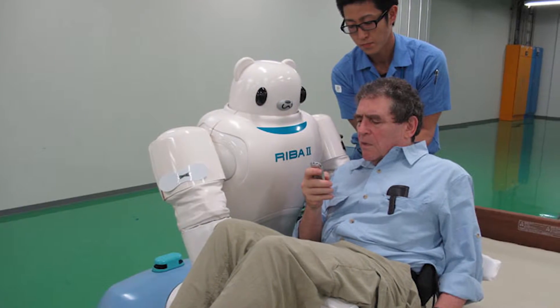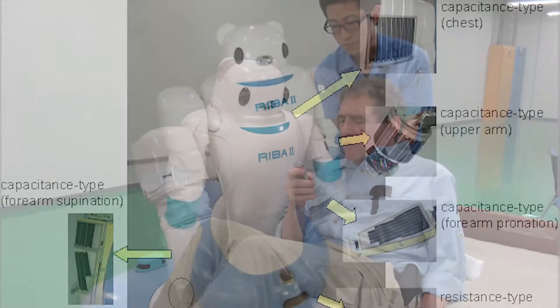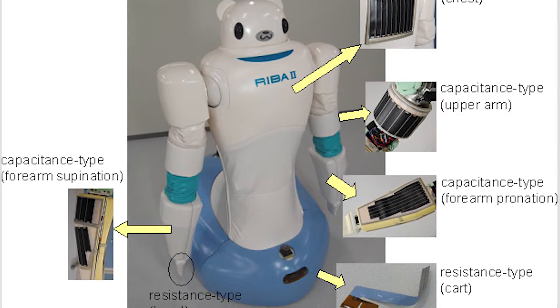Reba has specifically created joint positions and limb lengths designed for lifting a human. Its slim arms and joint structures have high rigidity and high output torque, while two cameras and two microphones allow it to follow an operator using visual and audio cues.